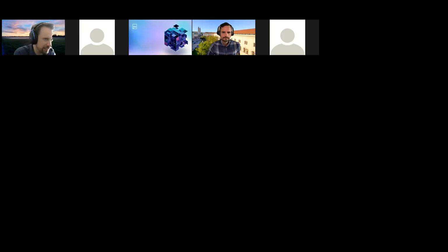So I will show you a few steps that you should test to see if it is really completely running. There are also reactions, I just see. Where are the reactions in Zoom? When I look at the participants.